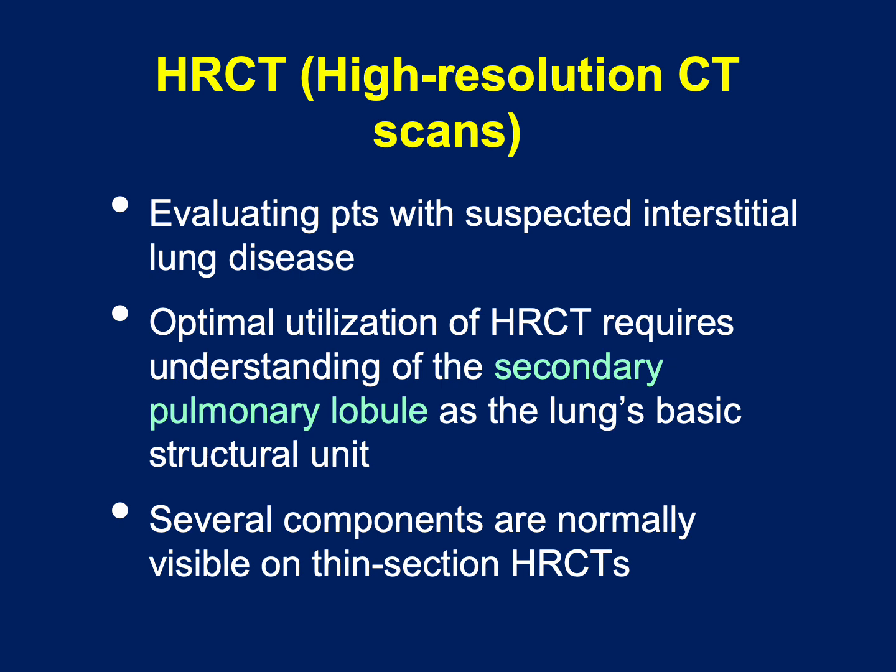High-resolution CT scans are used for evaluating patients with suspected interstitial lung disease.